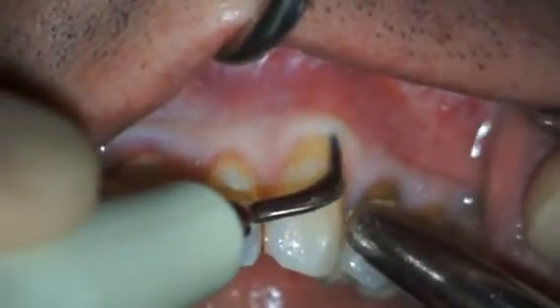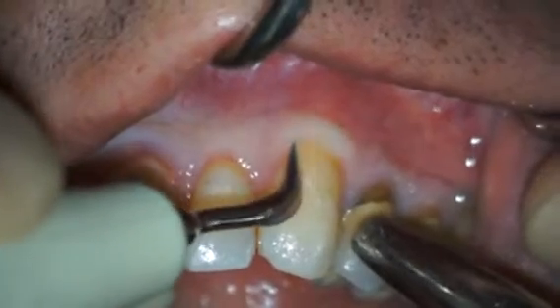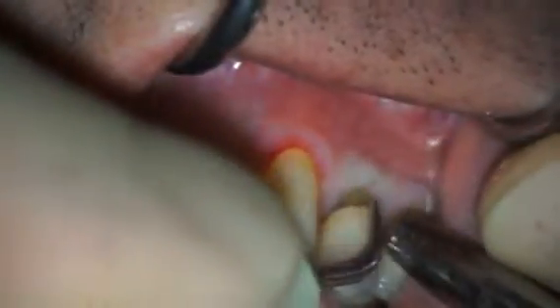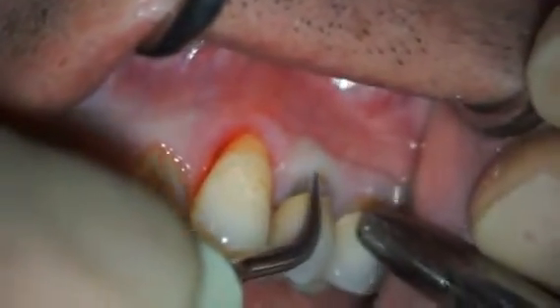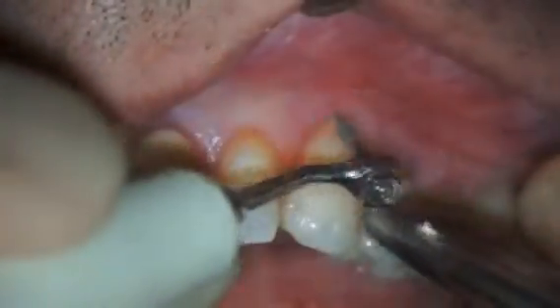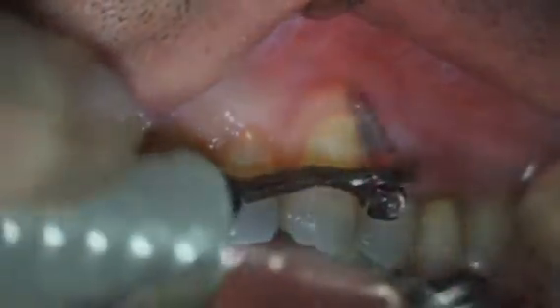Initial preparation of exposed root surfaces includes thorough scaling and root planing, as well as odontoplasty to reduce any cervical prominences of roots that extend beyond the confines of the alveolar housing. Root preparation begins with ultrasonic scaling of the exposed root areas using a fine-tip scaler. Care is taken not to traumatize the marginal gingiva. Further scaling is continued with a coarse diamond-coated football tip attached to a piezo scaler. A rotary finishing burr is then used to complete the odontoplasties to reduce the profile of each exposed root surface, improving the chances for successful root coverage.